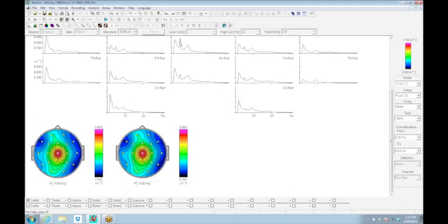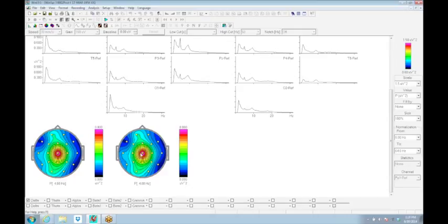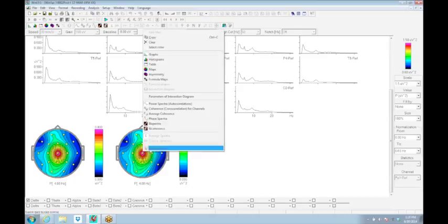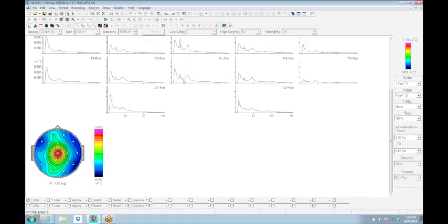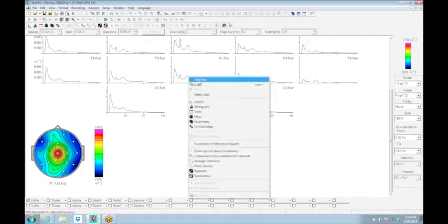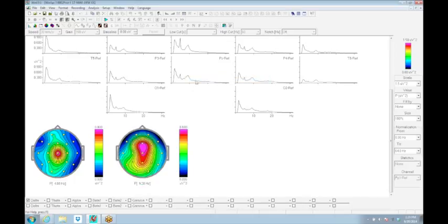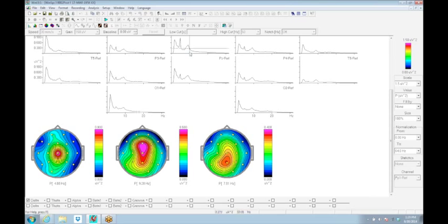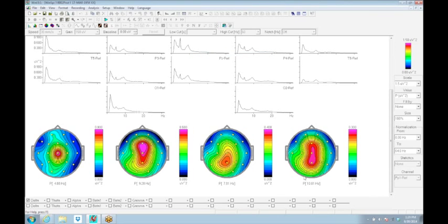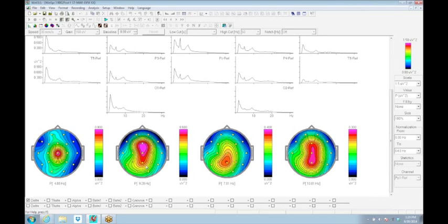I put the crosshairs at CZ. It didn't map it only at CZ. It mapped it wherever it was and gives us these contours around it. I just created a second map the second time through. I can do the same thing for the alpha peak. Here's the 9 hertz alpha peak. Alpha has a range. It's got a lower edge to it. The slower edge of alpha, you can see down below 8 hertz. It drops down below 8 hertz for the bottom edge. The upper edge goes up and gets up close to 10 hertz. We have a range of alpha. The power of alpha is dominant at 9, but you can see it's got a range of frequency. But it's also right along the midline.